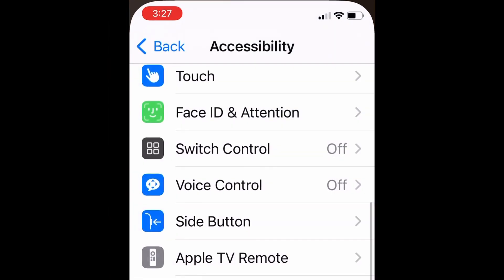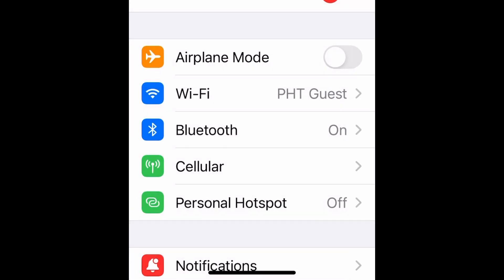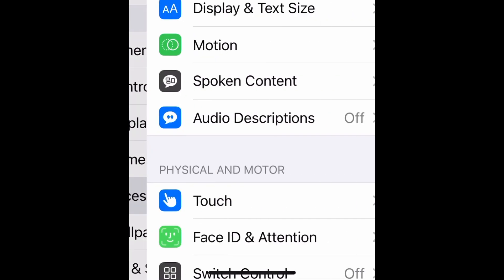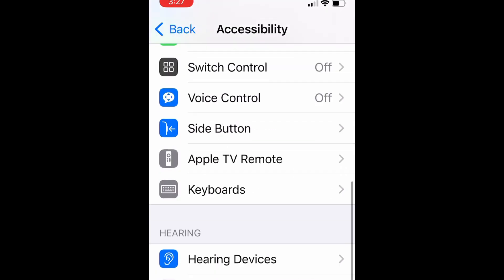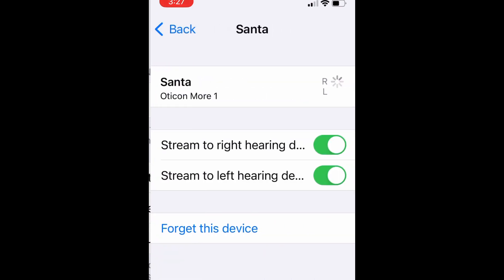So the problem is the hearing aid won't show up in your app. Close the app, go to accessibility, and go down to hearing devices. This is under your iPhone settings. In hearing devices, click on the blue hearing aids.